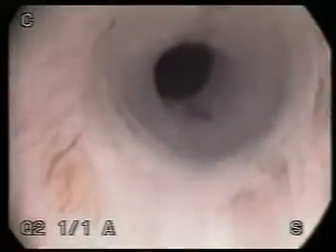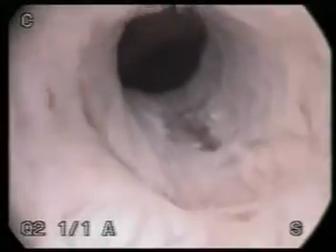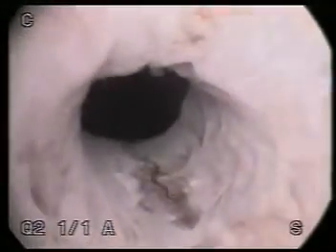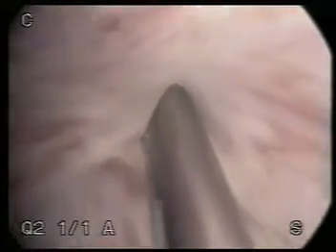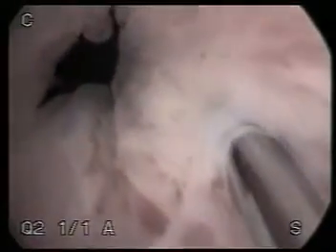This 65-year-old female patient has residual stress incontinence after a previous pubovaginal sling procedure. The urethra is well supported. At the 4 o'clock position, the scope is angled at 45 degrees until the bevel of the needle is within the urethral wall. The scope is then angled back parallel with the urethra, and the needle is advanced 1 to 2 centimeters towards the proximal urethra.